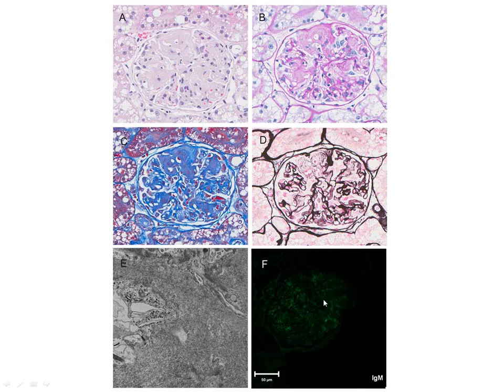And so, this might help you remember this, so I will mention it. The MDs talk about this appearance of the PAS, and sometimes the ones that have the tinctorial change in the trichrome, they actually call that waxy staining. And I think it goes back, at least according to Dr. Jeanette, to the day before they had histopathology, when you were doing autopsies on humans, and if they had amyloidosis, their kidneys felt like candle wax. When you took them out, you could stick your finger in it, and it would feel like you were putting your finger through soft candle wax.